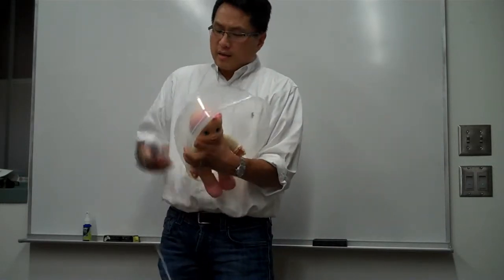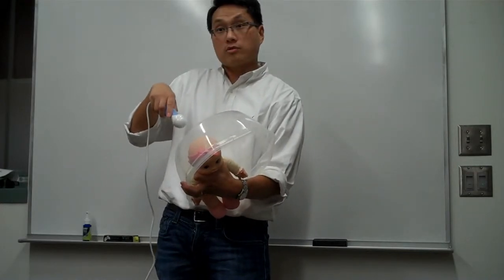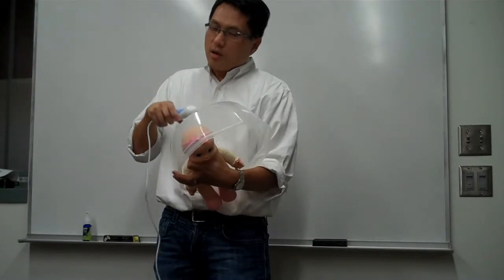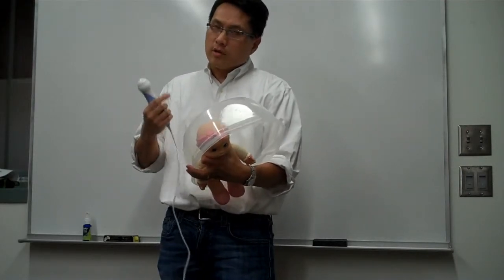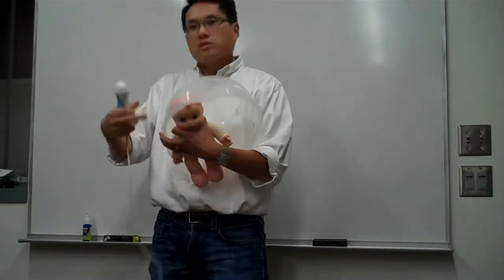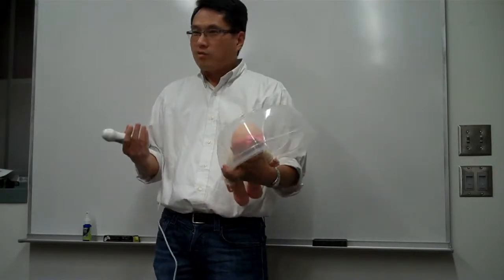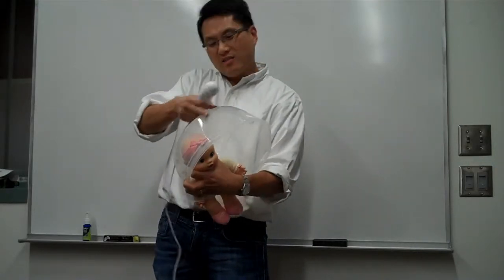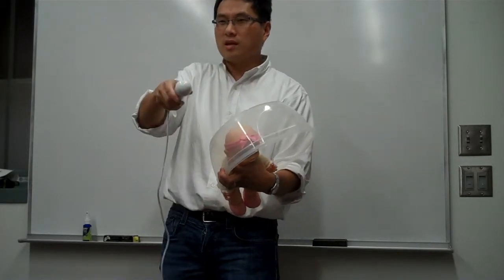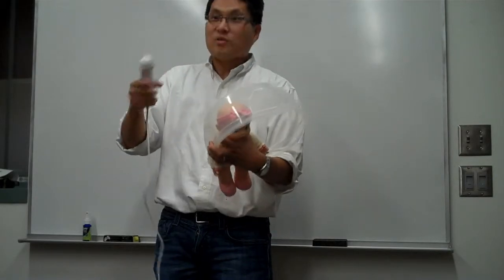But without that, there cannot be any air, because otherwise the ultrasound signal doesn't penetrate. And because we have to be able to do actual scans, those are the criteria. So the fetus has to be realistic. It has to be filled with some sort of water or gel that simulates amniotic fluid. And even the surface has to be like skin. Actually, when I do a scan later, I'm going to do a scan of my heart to show you what it actually looks like.